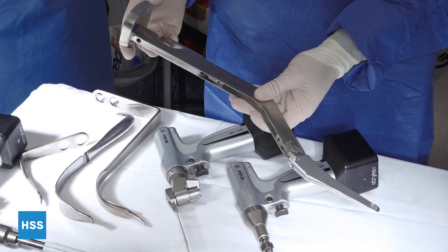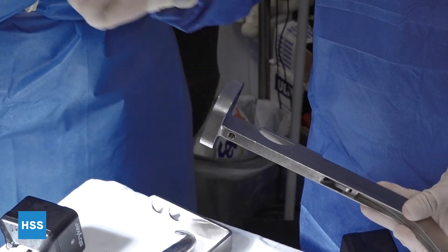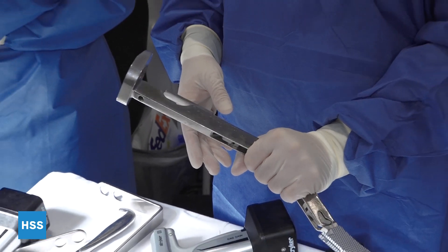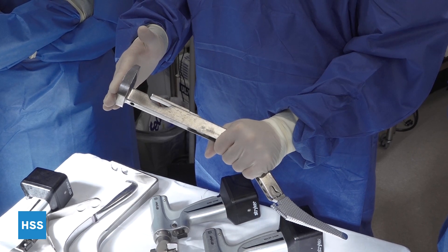For the broach and the broach handle, they have different offsets. At the end there is a strike plate which you strike with the mallet once you're in position, holding in the correct rotation and varus-valgus position. Then you strike the end of the broach handle with your mallet.